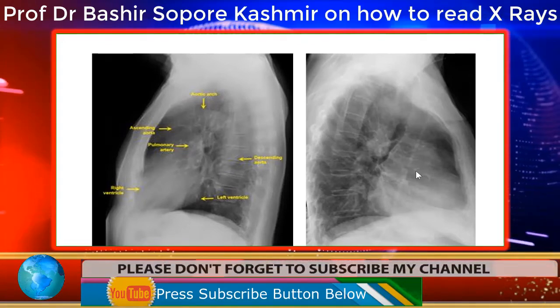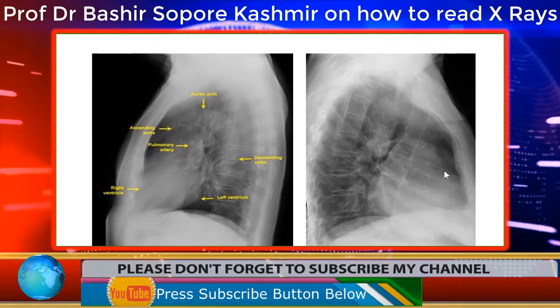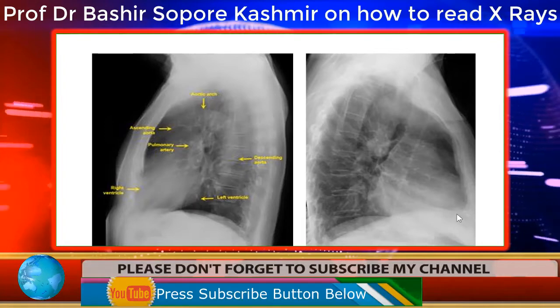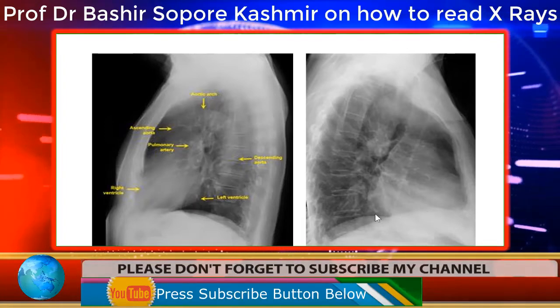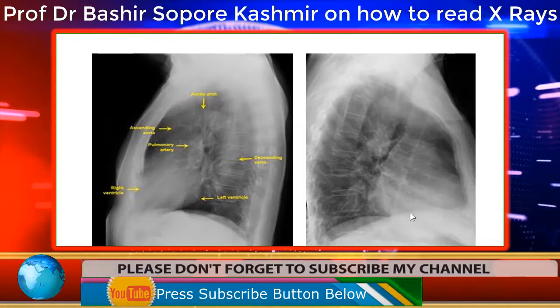Now here also, this is the shadow of the heart. This will form the left ventricle, this will form the right ventricle, and this is the right dome of diaphragm. Why I say it is right dome of diaphragm? Because it is taller than the left diaphragm. So this is another shadow. This is of left diaphragm, this is of right diaphragm.